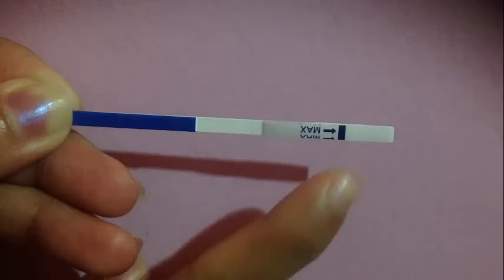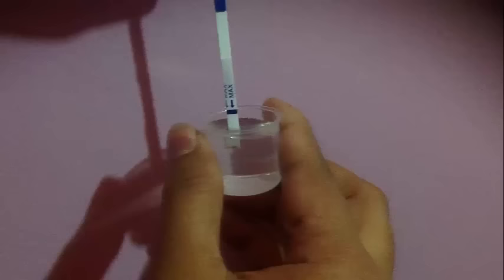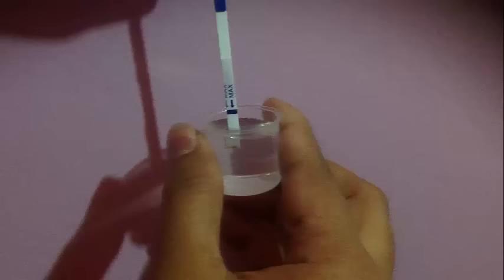Once you get your urine sample, you can't immerse the strip more than the maximum line, as I've shown in the video. After that, you have to keep it horizontally. Then you have to wait around three minutes and it shows the results.